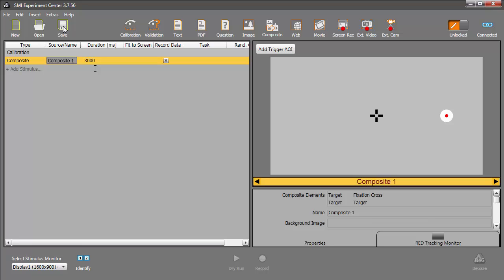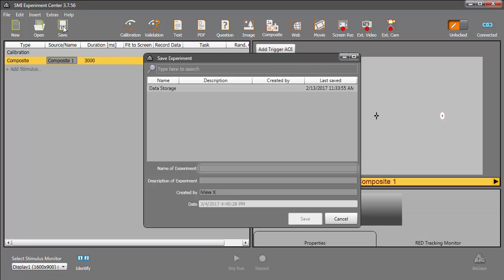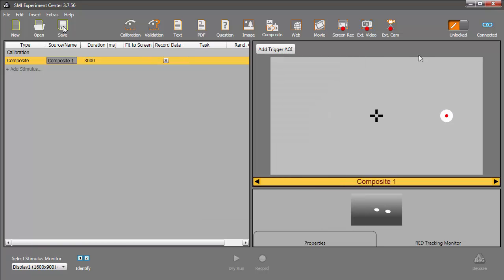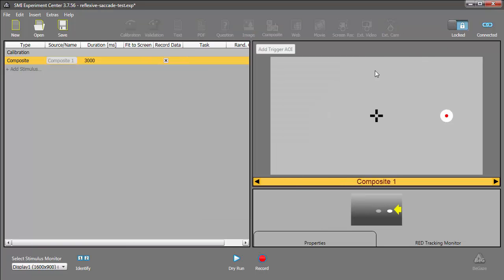To see what we have, I'll save the experiment, calling it Reflexive Saccade Test. Now, I can lock the experiment and start a dry run. There's my fixation cross and the circle.